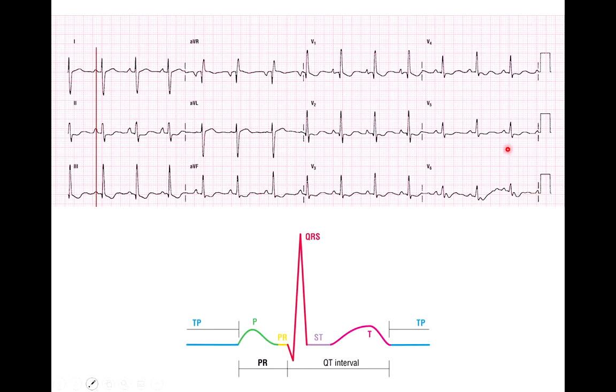Now that means what's happening over here is about 10 or 11 seconds after what happens over here. So we cannot directly compare what happens at this point in time to what happens at this point in time, because in fact it's 10 to 12 seconds later. In other words, the heart could have had a dysfunction that quickly resolved, and 5-10 seconds later we don't see that disruption. So we could have some abnormal rhythm in one area of a rhythm strip and another area of the rhythm strip that looks perfectly fine.